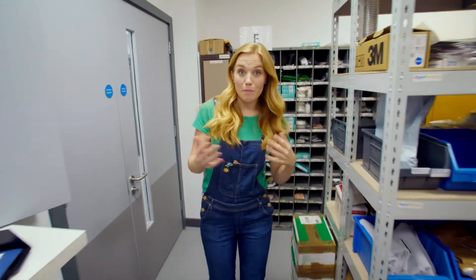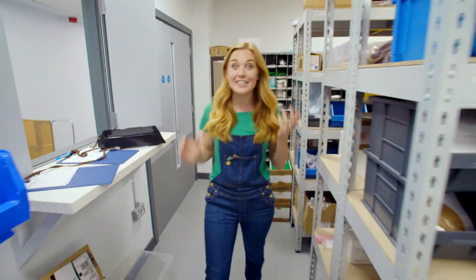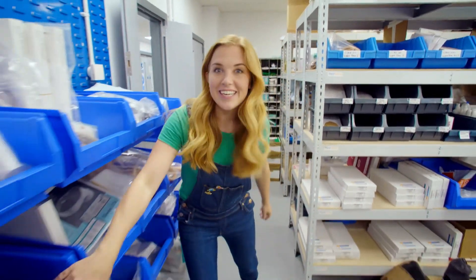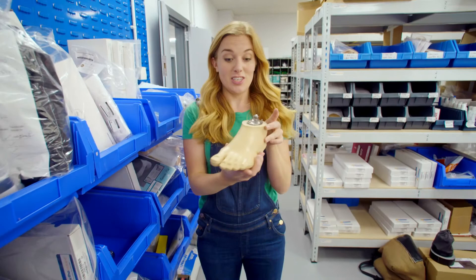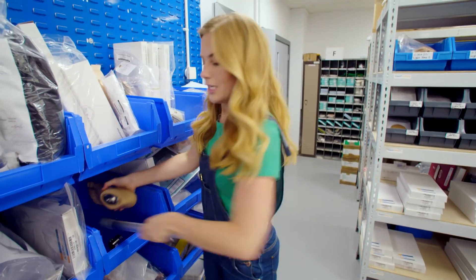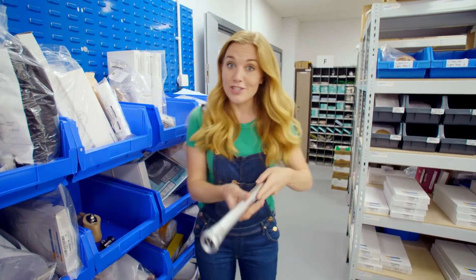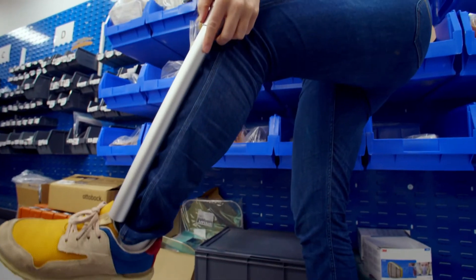The rest of the parts we need for our prosthetic leg are kept here in this storeroom. And here we are. This is the foot. And then this metal pole is going to be the shin. That's this part of the leg just here.